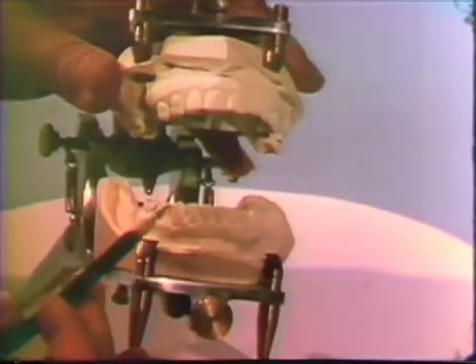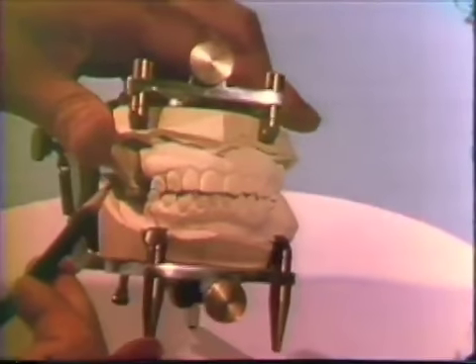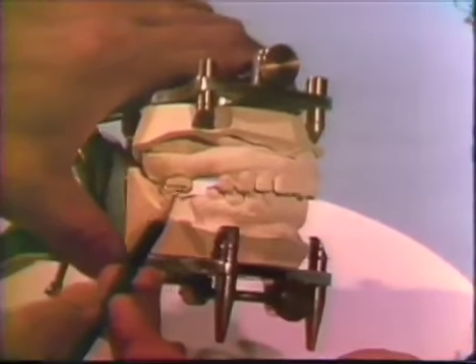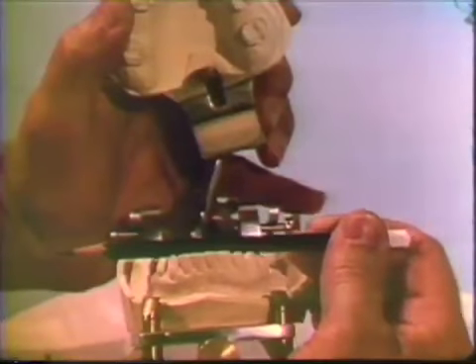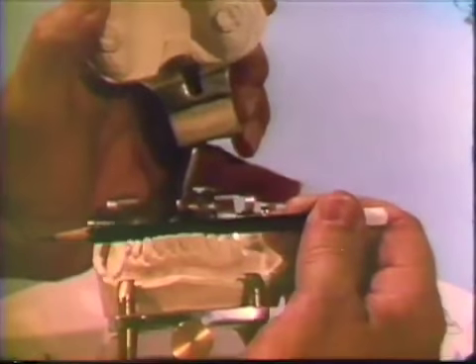Changes in the level of the posterior occlusal plane can be observed in relation to the anterior teeth and other commonly utilized landmarks. Variations in occlusal height bilaterally can be easily discerned.